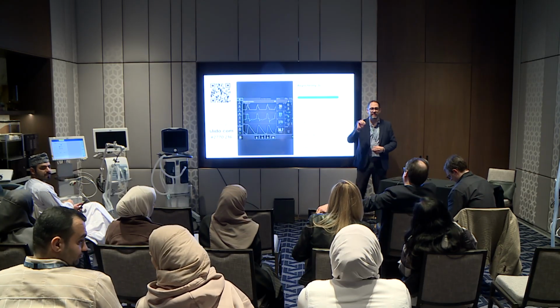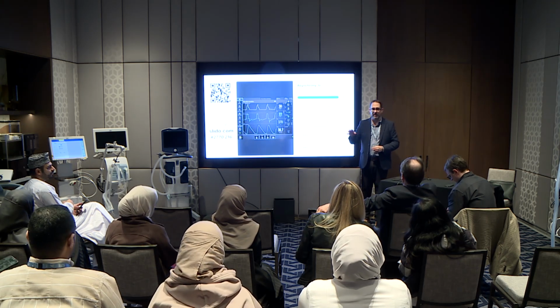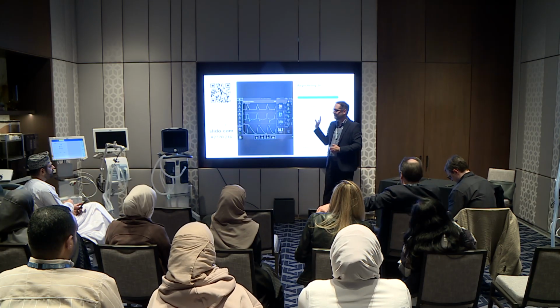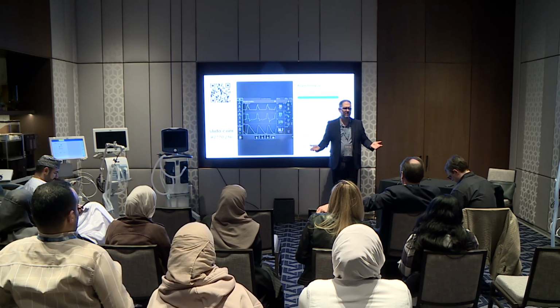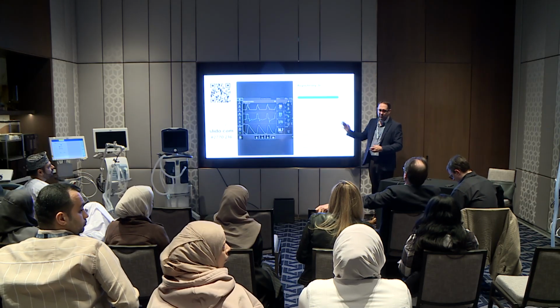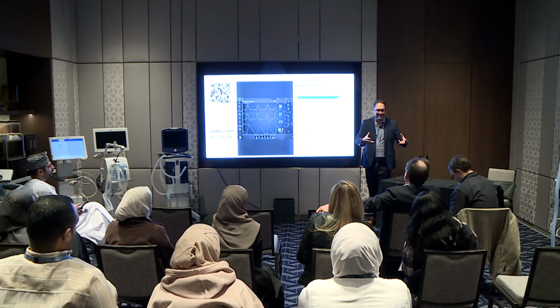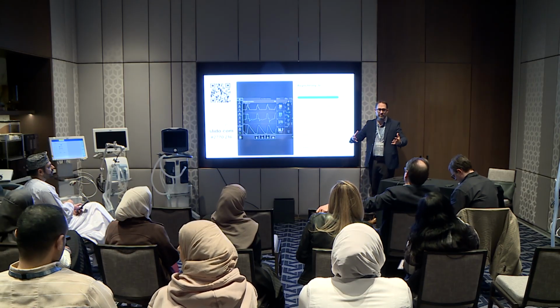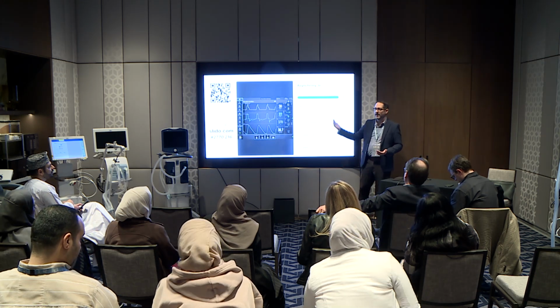No, so this is just to test whether or not they can breathe sufficiently on their own. I don't care what their blood gas is. If their blood gas is okay with this, it's because I've done this to them, but maybe if I let them breathe on their own, maybe the minute ventilation will drop a little bit, but the gas exchange is okay. So we can change it to CPAP also. Yeah, CPAP. It's whatever you want to do to see if the patient has a good enough respiratory drive. What you'll find with reverse triggering is some patients, when you try to see if they will take over, they don't want to breathe very much at all, and therefore you have to continue to take over.